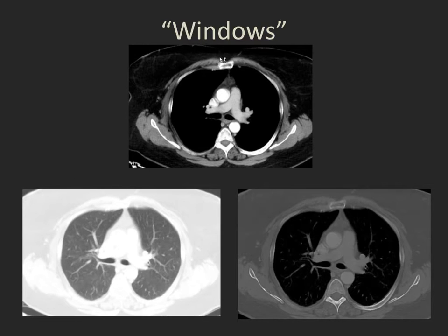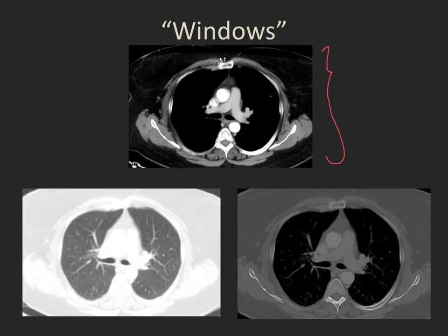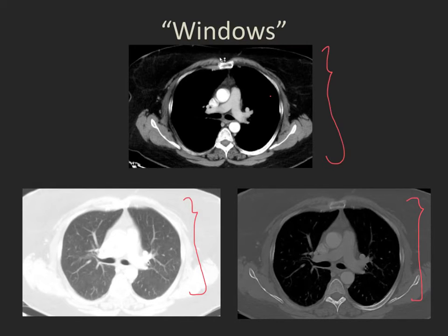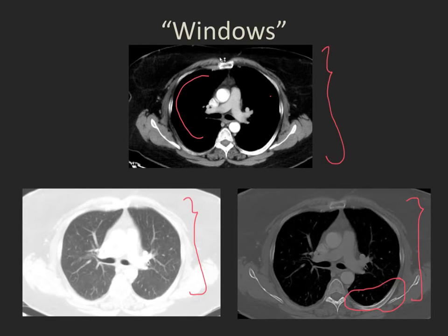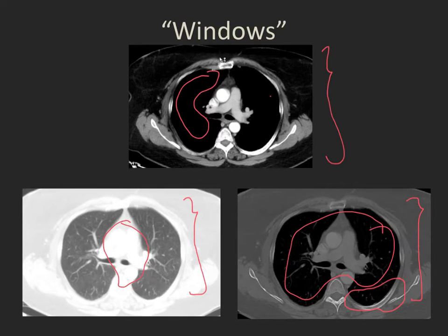For example, here is the same set of axial reconstructions — a soft tissue reconstruction — displayed in three different ways: a soft tissue window optimized to look at the soft tissues of the mediastinum; a lung window on the bottom left, optimized to look at the lung parenchyma; and the same data displayed on a bone window, allowing us to look at the osseous structures of the thorax. Notice that we really can't evaluate the lung parenchyma on the soft tissue window, the mediastinum on the lung window, or anything other than bones on the bone window.